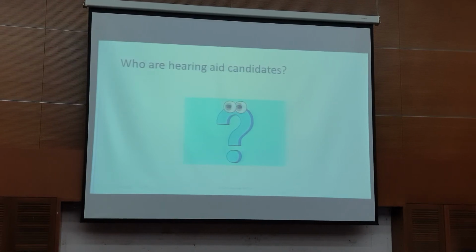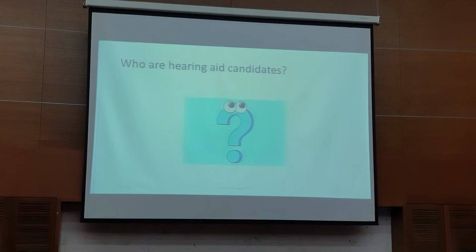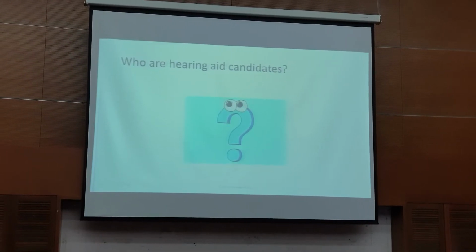Tapi now single-sided deafness is also a big issue. We've just heard last week or so, there's approval for cochlear implant even for single-sided deafness, FDA approval, yeah? In Europe, SSD, a very large number have actually gone through cochlear implant.